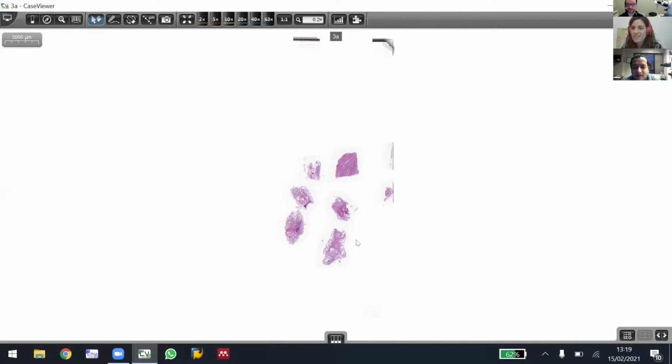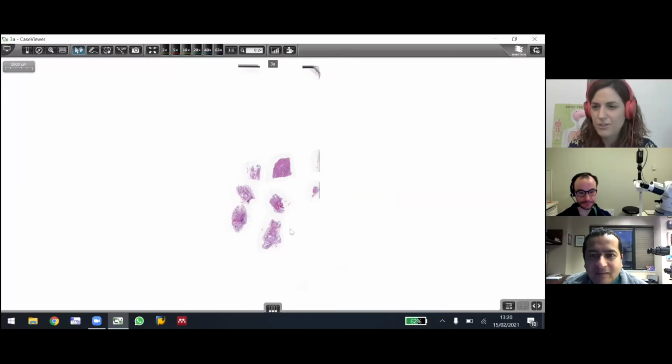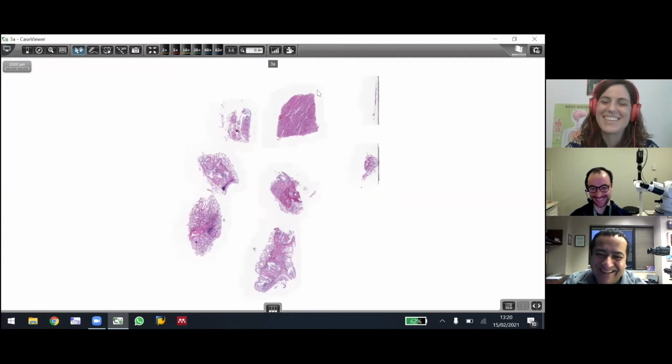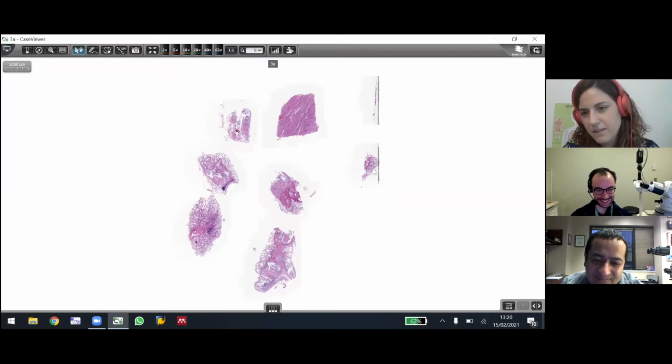Here we have a cryobiopsy. I don't want to tell much before showing. I'm going to show it to you first, and then we can talk about the history. Okay? Then we have the classic kidney here. Oh, yeah, I was wondering what that was. Where is the kidney here? And we have the 5 pieces, or maybe here there is a little piece, 6 pieces. Okay, I'm going to show the pieces.